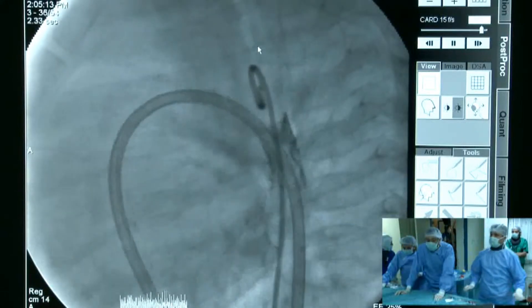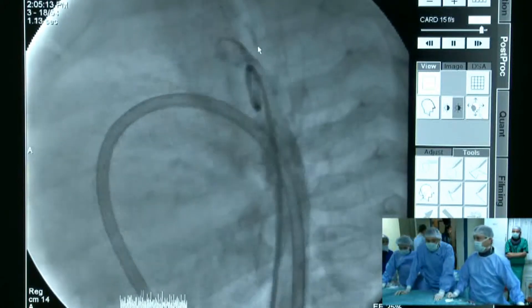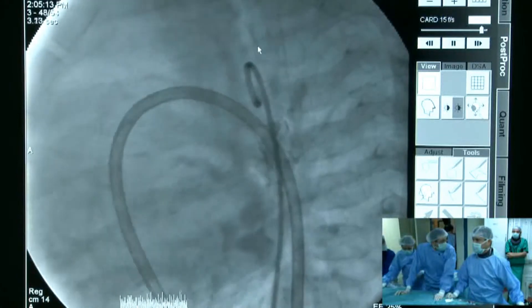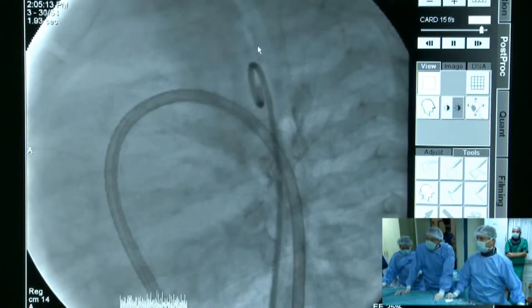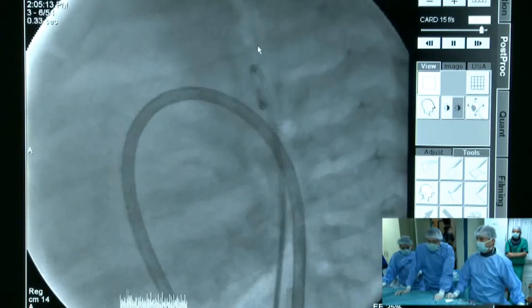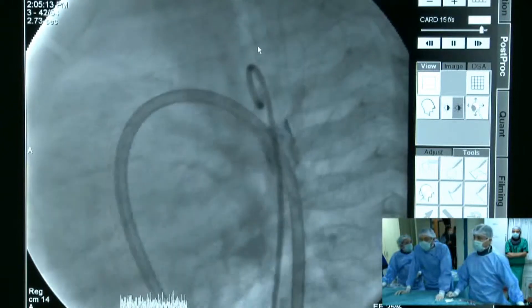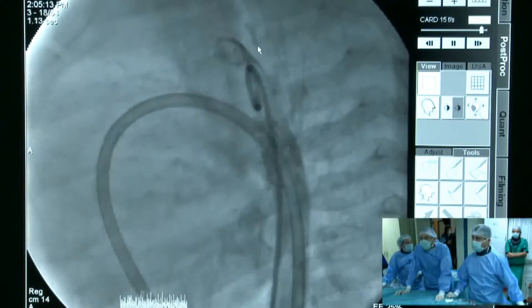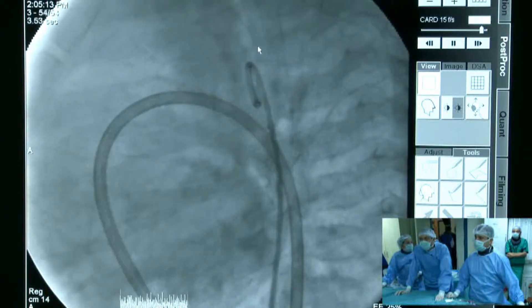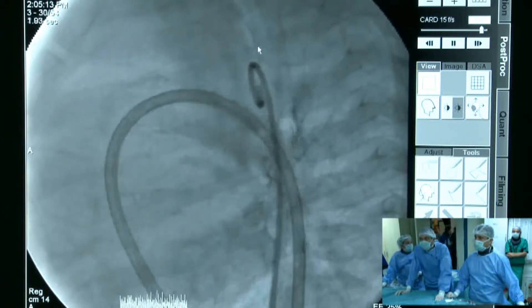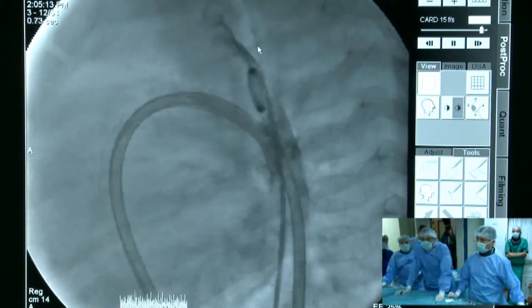What are the pressures? Mean pulmonary artery pressure is 28 mmHg — that is nearly normal. But we have a lot of left-to-right shunt as seen from the left ventricle diameter. There is a comment from Omar: because this is a very short PDA and there is not much diameter from the aortic side, we have to be careful with what we select. Have you got that question?